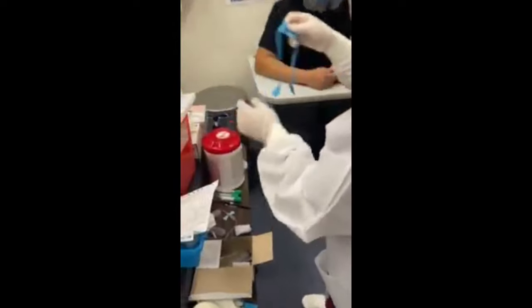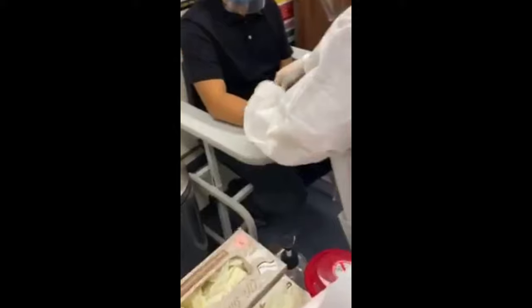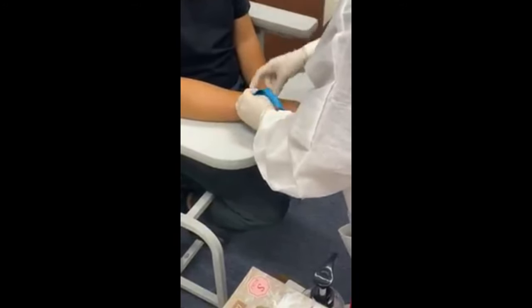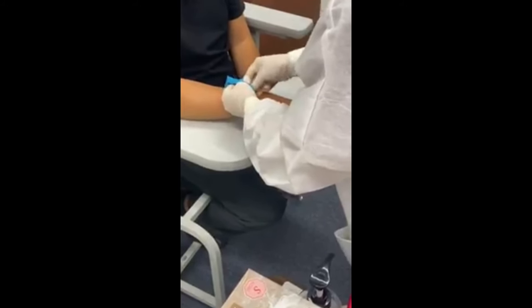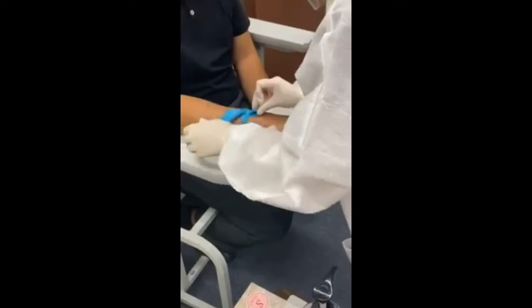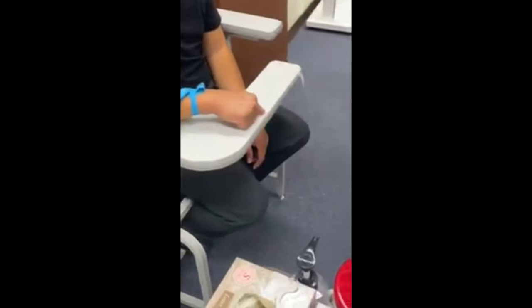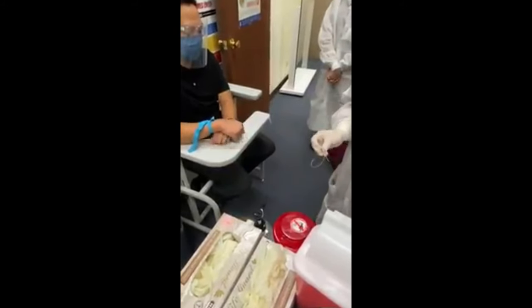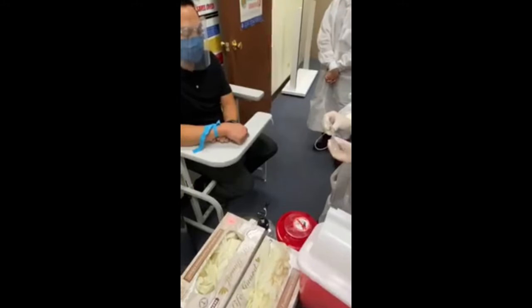Okay, so I'm going to put back the tourniquet. So just get this one. Yep, the bottom one. Yep, perfect. The ears, okay, and then the top, perfect. Okay, good tension. Then put this on. Not yet. Oh yeah, you can. Usually, you could assemble when this was drying, but yes, fine.